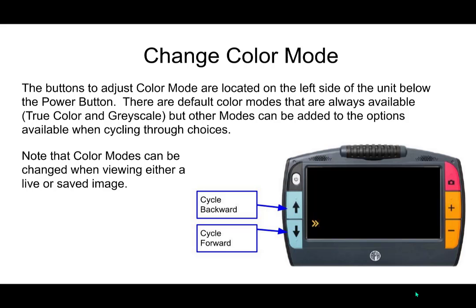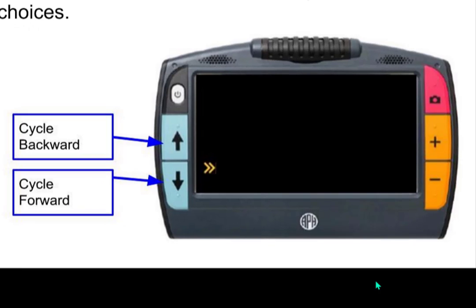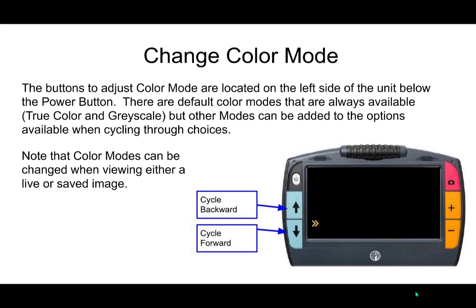The change color mode buttons, we've talked about these as well, but as a review, they are on the left side, and they are sort of a light blue in color with arrows on them, and they are the bottom 2 buttons on the left. They take up a good portion of that side. The default colors are always available, the true color and grayscale, but other modes can be added in the options, and we'll talk about how to do that.